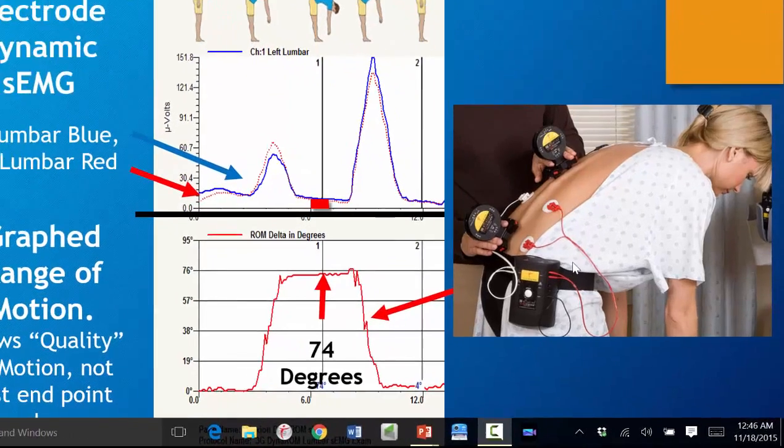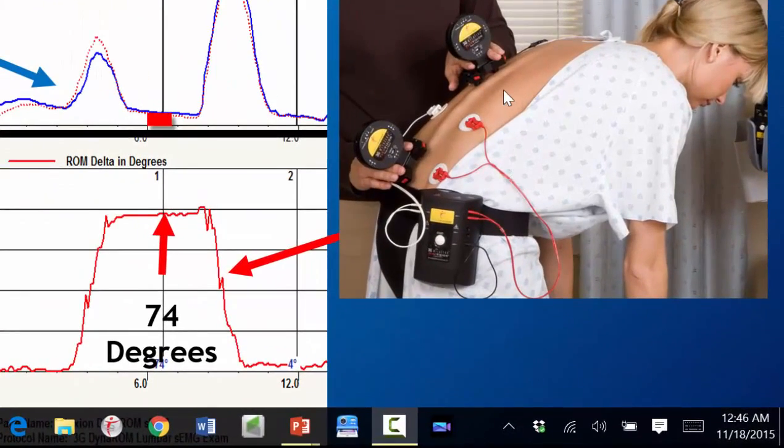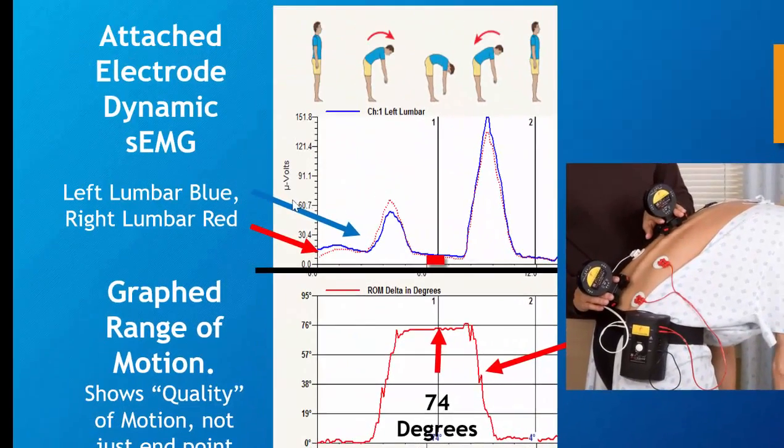We're attaching EKG electrodes about the spine, measuring levels of muscle activity on left and right sides. The left lumbar is in blue — we're graphing our muscle activity measurement, dynamic EMG up here. The right lumbar is in red. Here the patient goes bending in a flexion, muscle shut off — the flexion relaxation response — and they fire again to return to neutral.